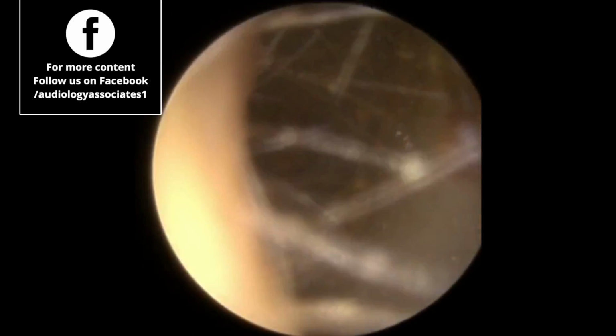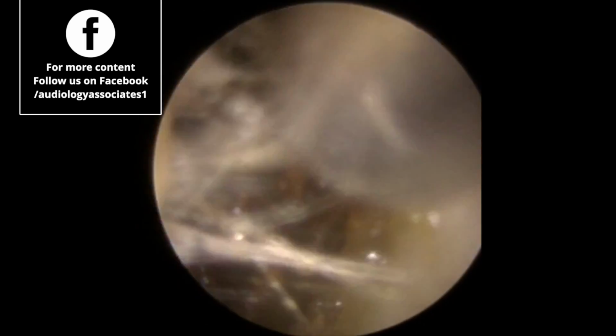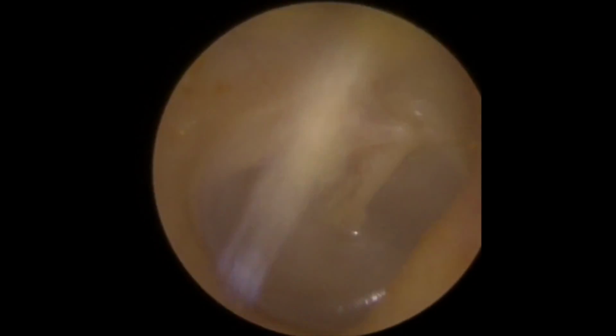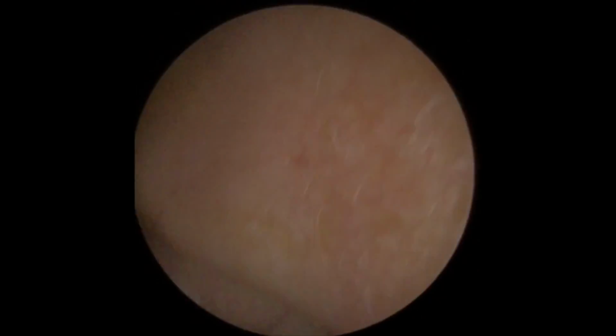There, we're just working the leading edge of this wax here, just moving it across from the right to the left hand side, trying to turn and spin the wax so that we get a much more flat surface to work on, so we get a much better suction grip. You can see using the wiggle there just to get that out, but it hadn't quite got the grip, so it broke away there. You can see it's quite big, it's struggling to get out of the canal. There we go. And there we are, it's a lovely looking eardrum there.